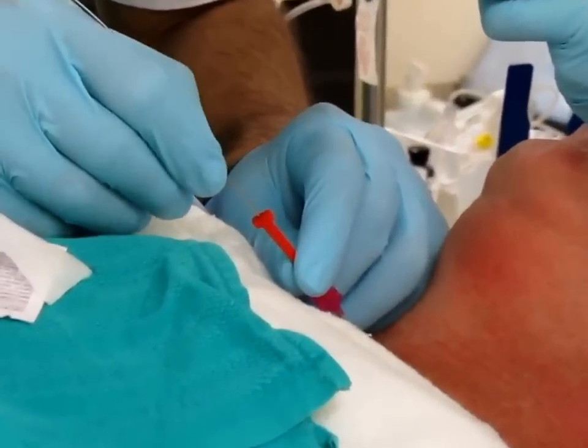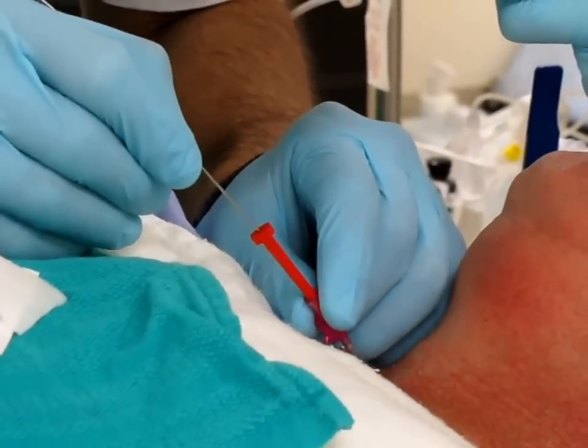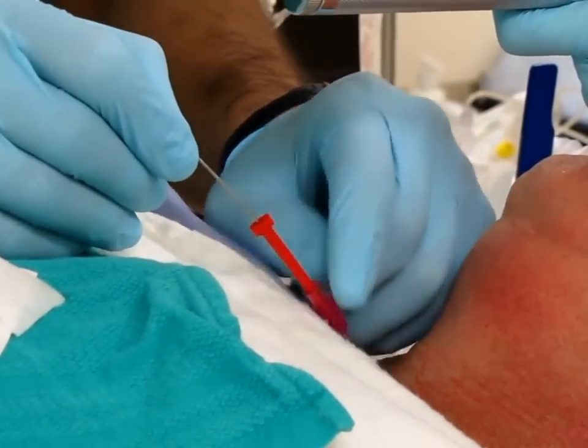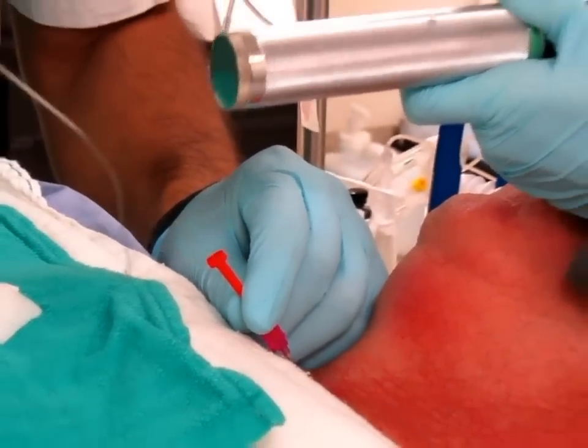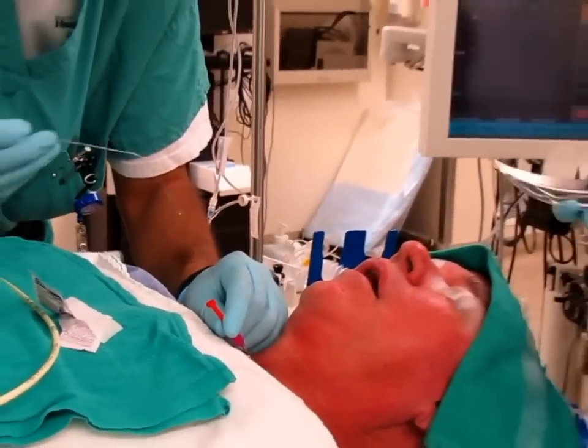We confirm your placement. Take your guidewire out if there's too much resistance. And we confirm your placement.